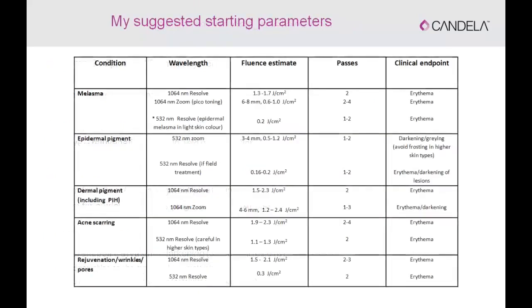I think this is an important slide, and I will leave this on the screen for a few minutes. I want to warn you not to just copy and paste exact parameters, because that obviously depends, again, on the condition that you're treating, the skin type, the sensitivity, and also the clinical endpoint. But this is a rough guide of how I approach things when I'm using the PicoWay.